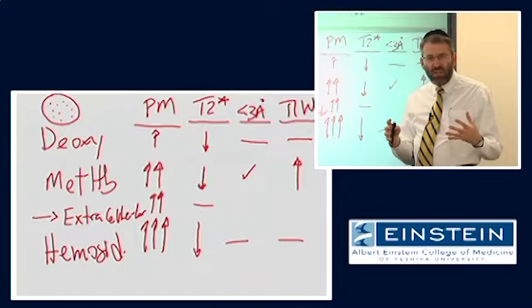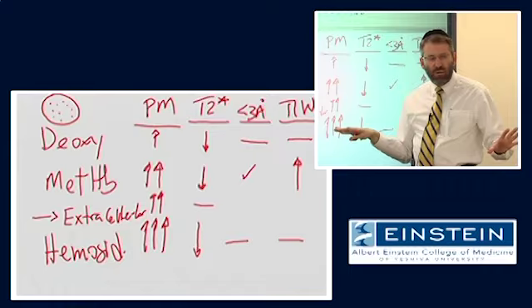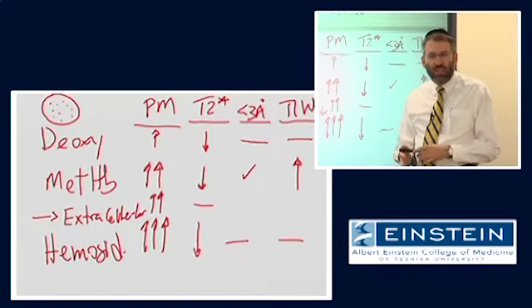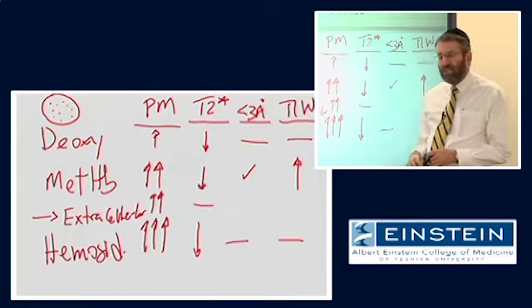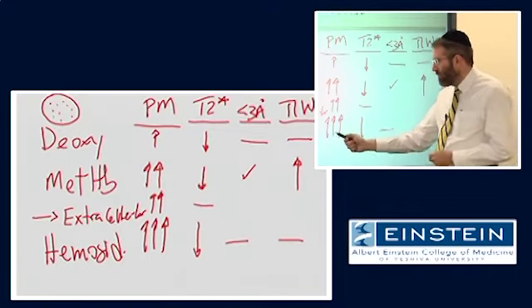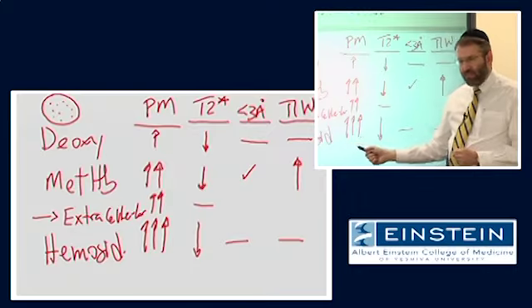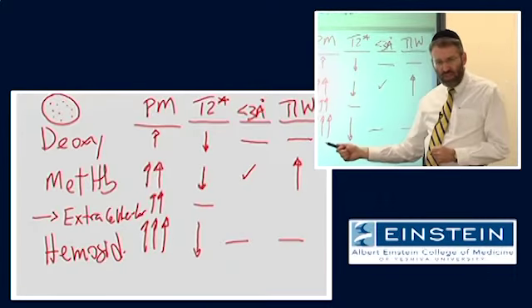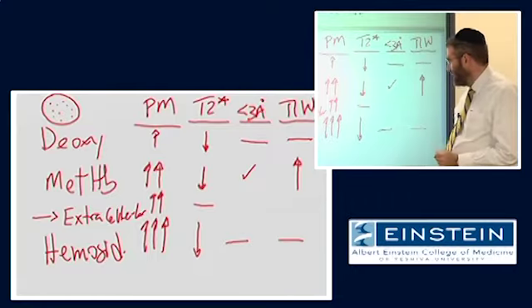But if all of a sudden within that voxel there's a uniform concentration of methemoglobin, there's no more gradient of magnetic susceptibility. And when the macrophages take it up, then you... Exactly. So hemosiderin, first of all, is much more paramagnetic to start with, but the hemosiderin is localized within these inflammatory cells. Absolutely right.